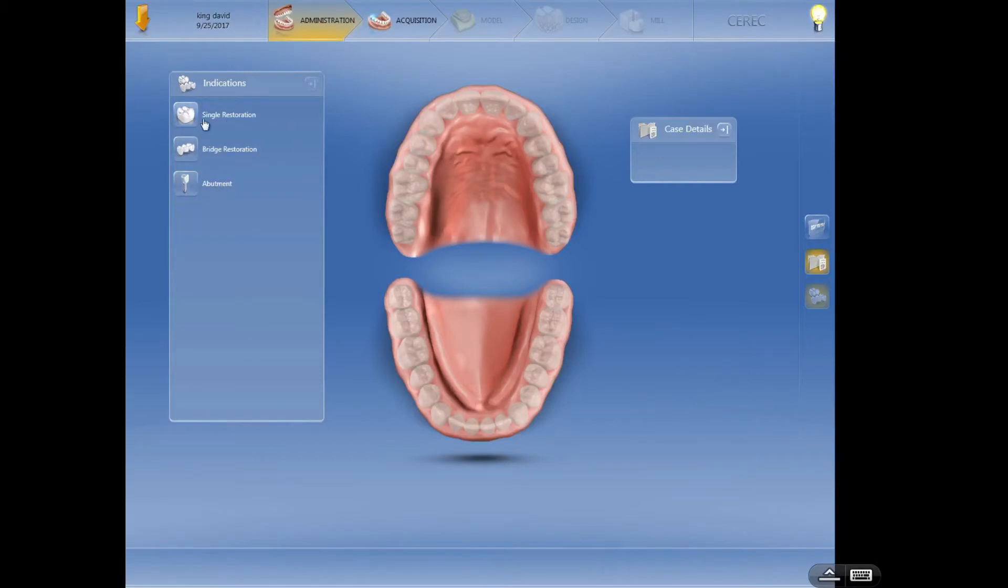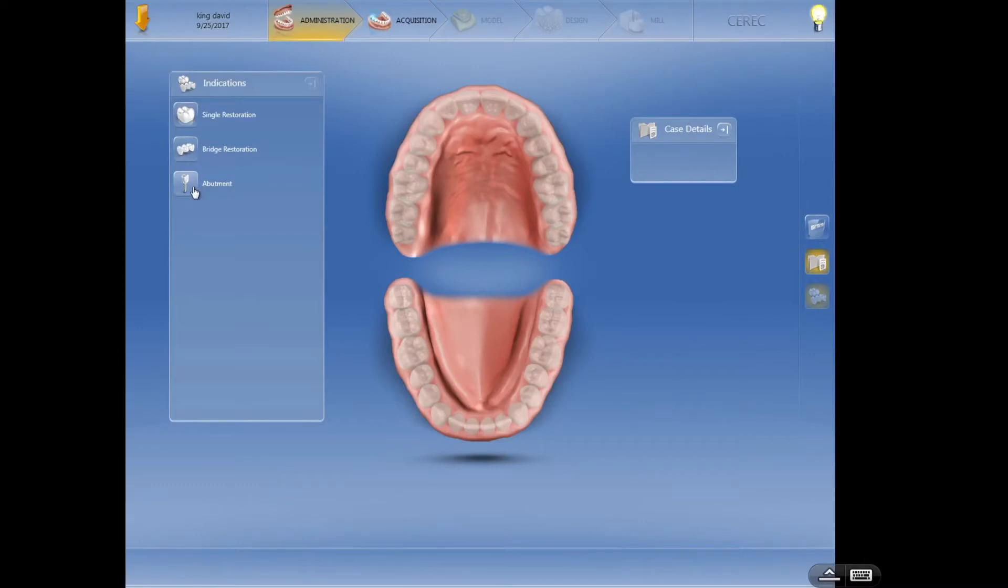So three choices: single, multiple, or abutment. With this version of the software I can't do a bridge on abutments yet, but we could get around that if we wanted to. That's a little bit further down the line as far as the training is concerned, so I wouldn't worry about it at this stage.